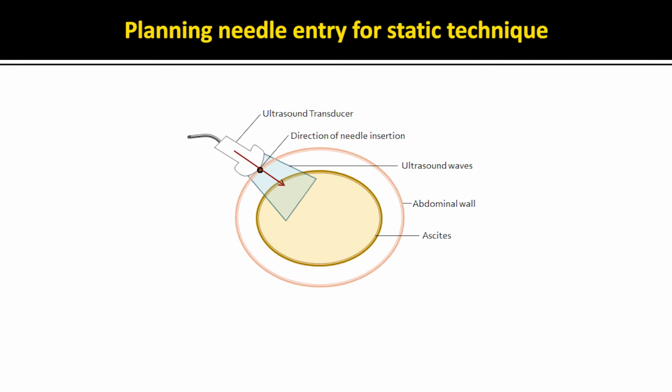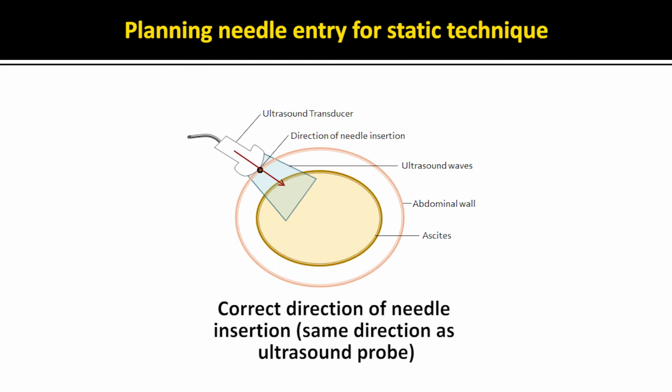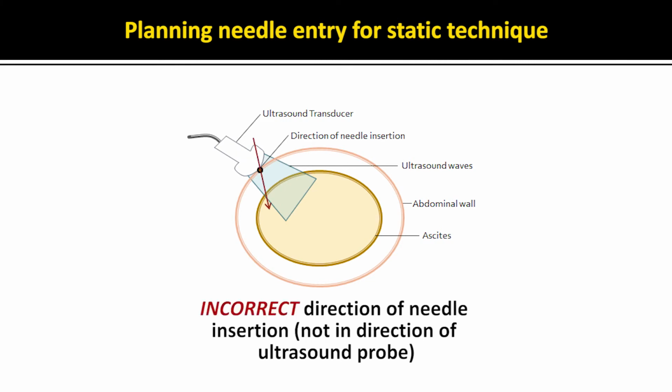earlier. Paracentesis using bedside ultrasound can be done using dynamic technique, direct needle visualization, or static technique, marking with ultrasound and then performing without direct visualization. Radiology often performs the procedure using dynamic technique, whereas at the bedside, static technique is most often used. One important point when performing static technique is to pay attention that the needle be inserted in the same direction that the ultrasound was facing when bedside ultrasound was performed.